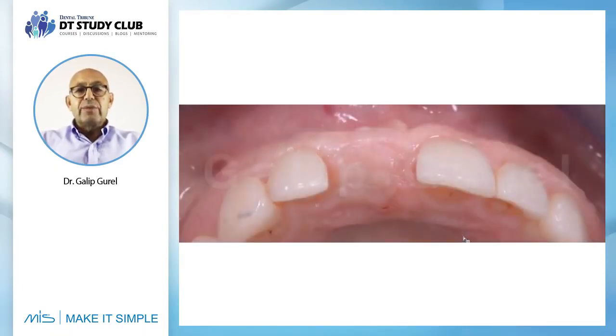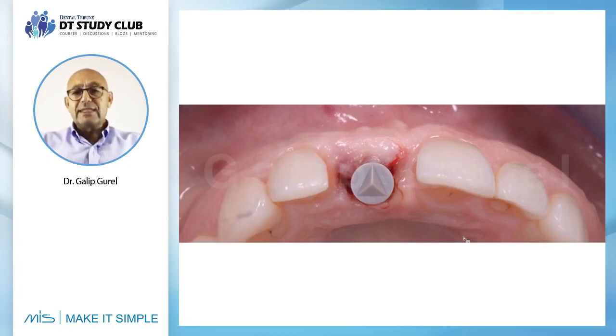And finally, we will go into that. So Junaid is punching the hole, reaching to the implant head, and then we're placing a tie base, and we are getting ready to make a digital impression.